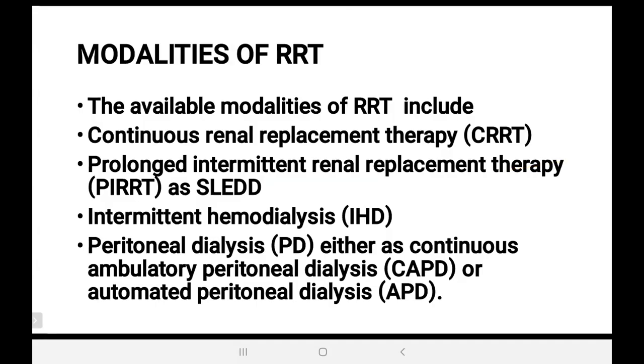The modalities of renal replacement therapy available include continuous renal replacement therapy, and as has been added, the role of hemoperfusion is important, as will be explained to us by Professor Ronco. Then prolonged intermittent renal replacement therapy, PIRRT, an example being SLED. In fact, most of us in these very sick patients, because of the rarity of continuous renal replacement therapy, are quite familiar with SLED, and it's extremely important in these situations because of the need to go slow: slow blood flow, slow dialysis flow, a longer period of dialysis being the mainstay in the concept of SLED. But this will again be made clearer to us by the expert, Professor Ronco.